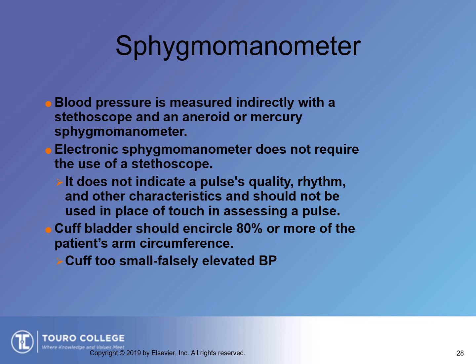I guess if I were working in a cardiologist's office where my focus was blood pressure instead of an acute care setting, I'd be more focused on the sphygmomanometer, but I'm really not, except in the size of the cuff. You have to use the right size of cuff for the patient's arm. And there's a ton, all the way from infant to a thigh cuff that we use on morbidly obese patients.